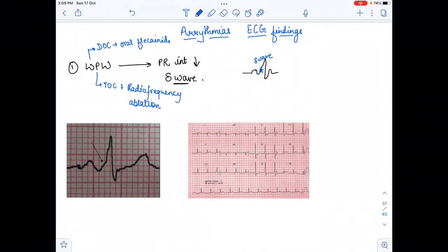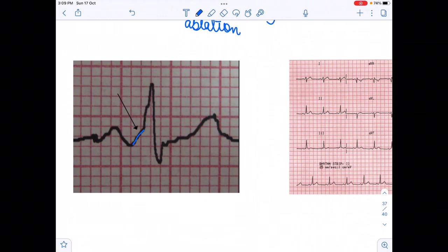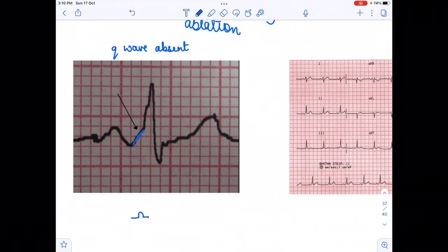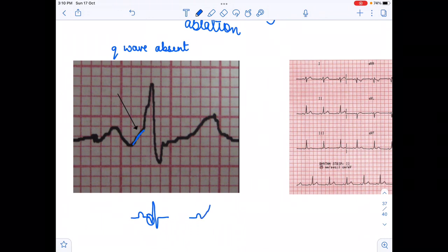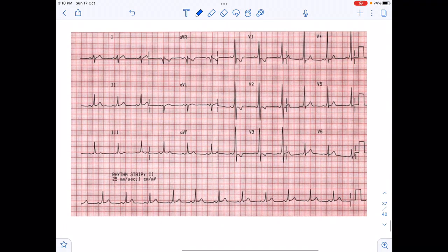These are the findings of Wolf-Parkinson-White syndrome with the drug and treatment of choice. On the ECG we see a slanting between the P and R wave. The Q wave is absent in WPW syndrome. Because the Q wave is not there, from the P wave there is a slanting — this raising slope is the delta wave, which is why the PR interval is decreased.